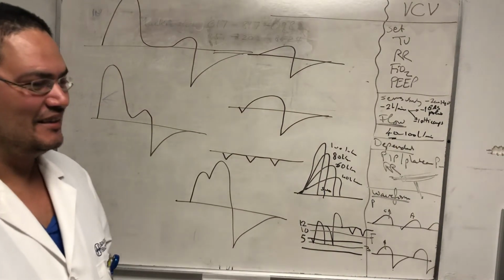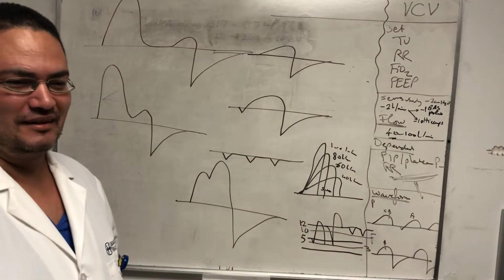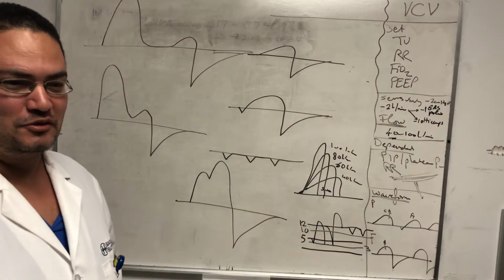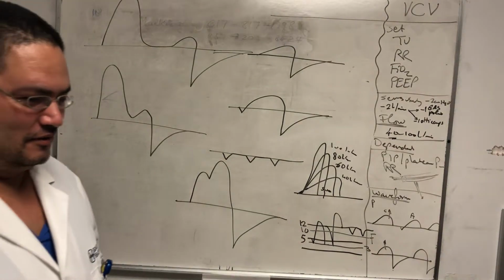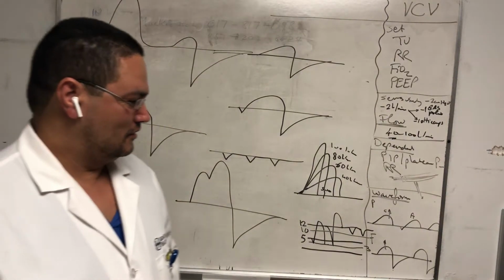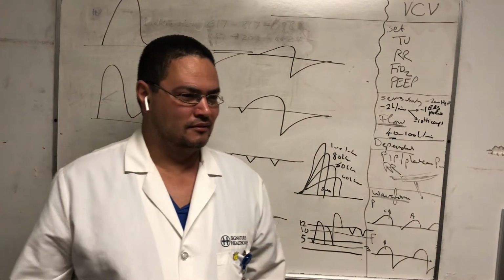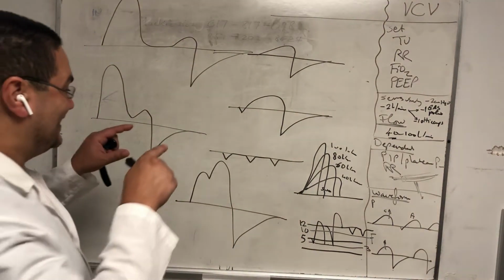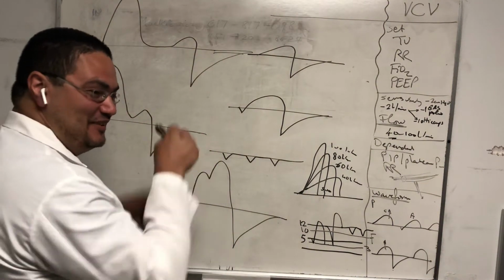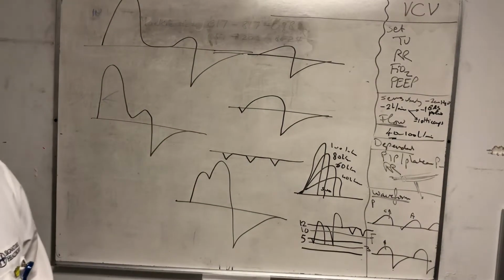I had an imposter intensivist, a trauma surgeon who used to think that he's an intensivist. So he would come to the room, and this is the vent behind. He's like, so what's the setup? If you're an intensivist, you can't control your hands, they're all doing this on the vent. But anyway, what's happening here with the waveform?